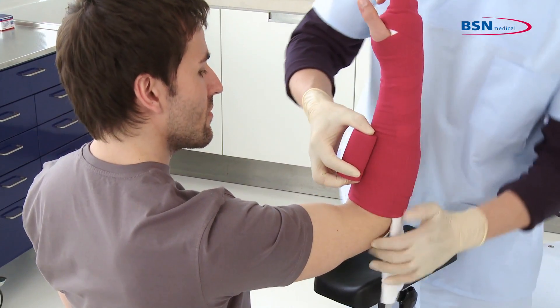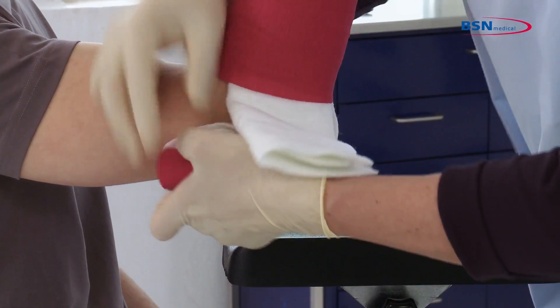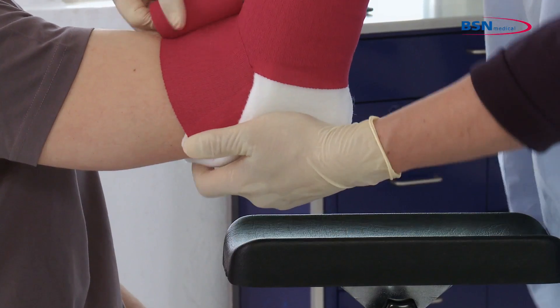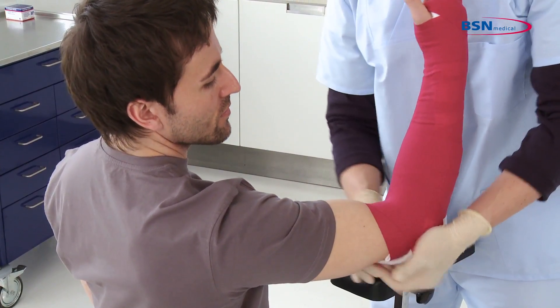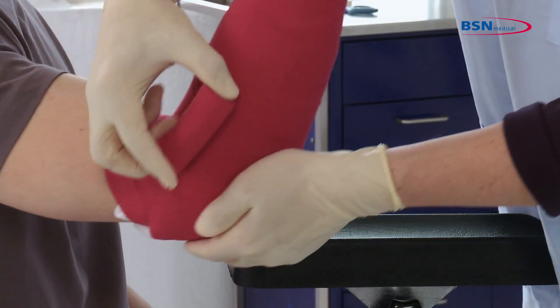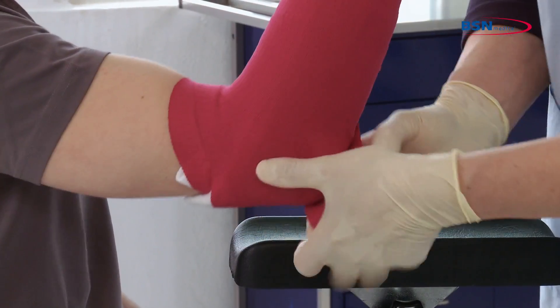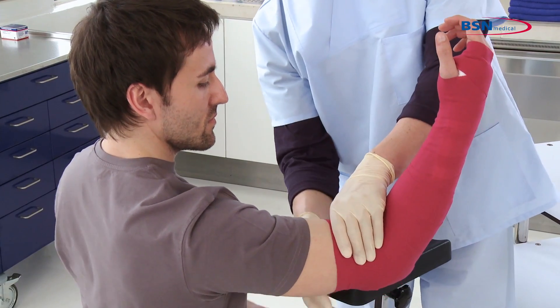Position the patient's elbow at 90 degrees. Fold one side of the excess material under the elbow and secure with a bandage. Next, fold the other side of the splint also under the elbow and continue wrapping the bandage around the elbow. At the end, fixate the bandage with tape or a hook and loop fastener.